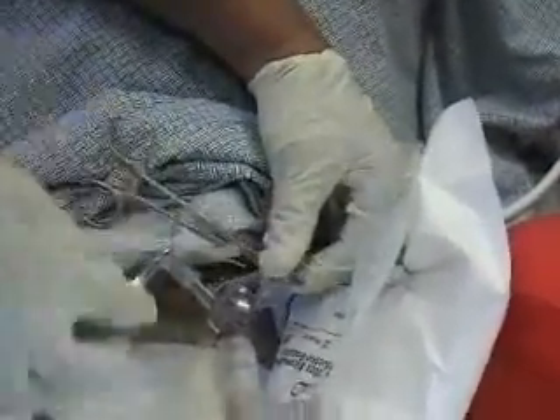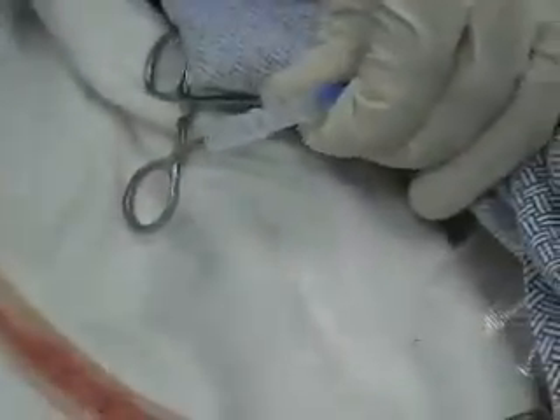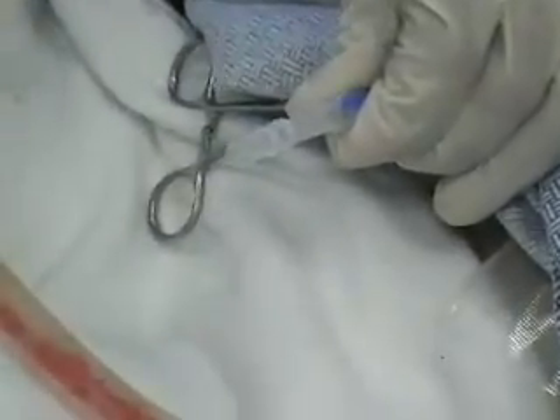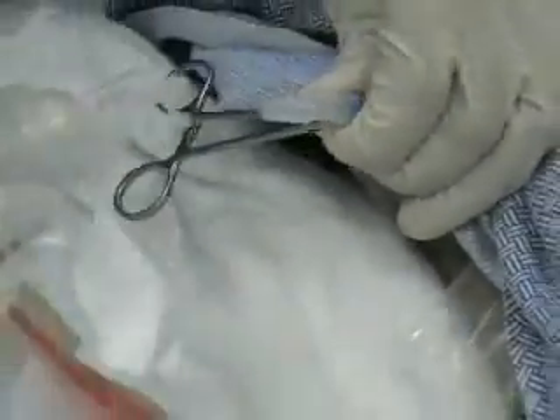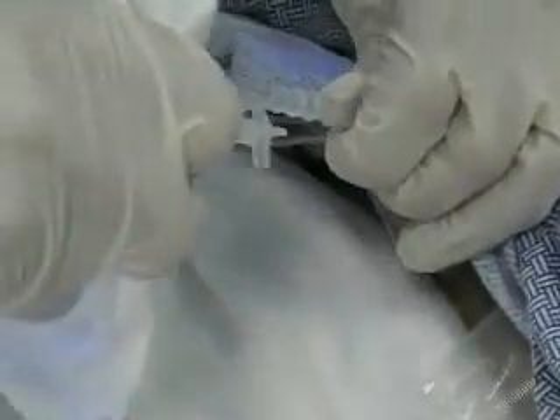So we're going to briefly go like that, pull out here, not touching anything. So we put the connector on there — this has negative pressure — and then stick it on.